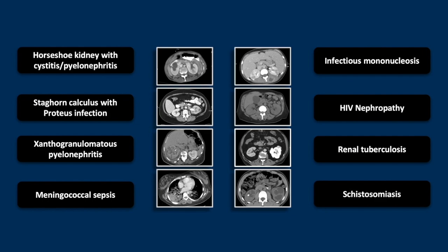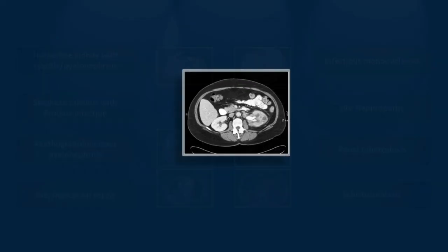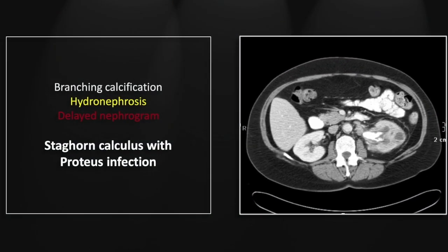Our next case is a staghorn calculus with associated proteus infection. There is a branching collecting system calcification in the left kidney which represents our staghorn calculus. There is also moderate hydronephrosis suggesting that is an obstructing calcification. Lastly, there is a delay in the nephrogram on the left suggesting that that obstruction has progressed and resulted in delayed perfusion as well.